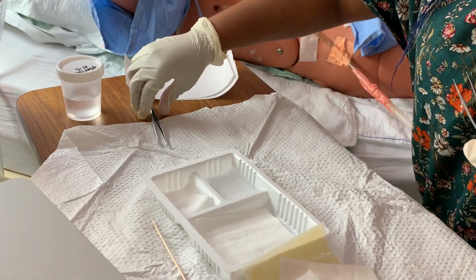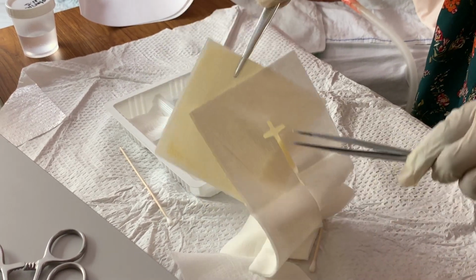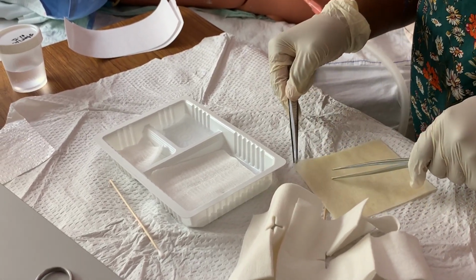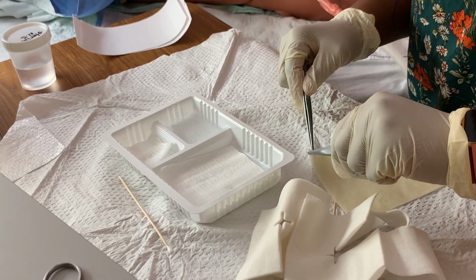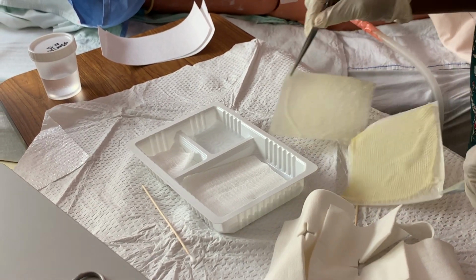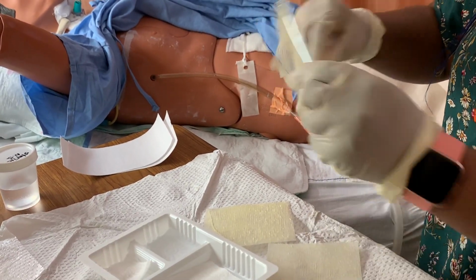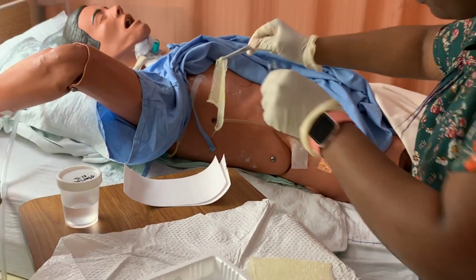So now I'm gonna get my Jelonet. Now I've done that, so I'm just gonna put it on.